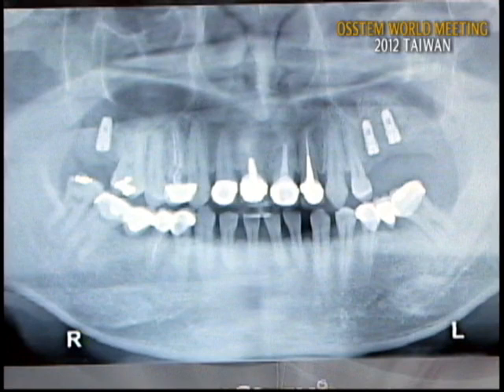Well, I think the position of the implants are not bad, and it's better to perform second stage surgery about 5 or 6 months later. Because of a nice surgical kit, the surgery was successfully finished. Okay, thank you very much.